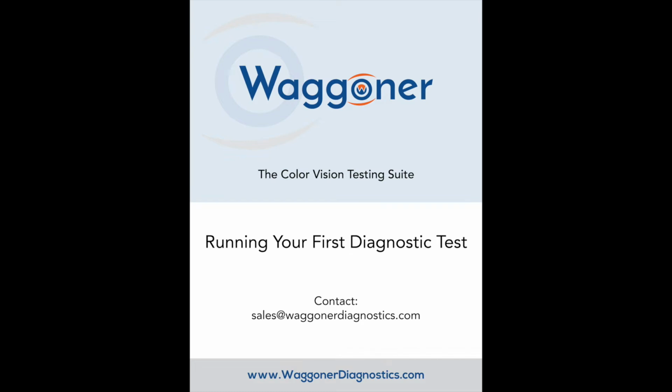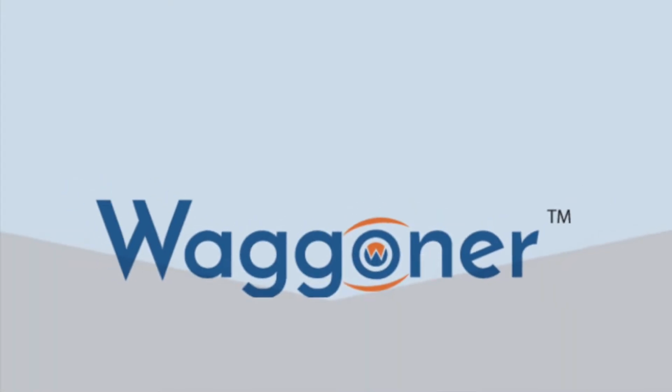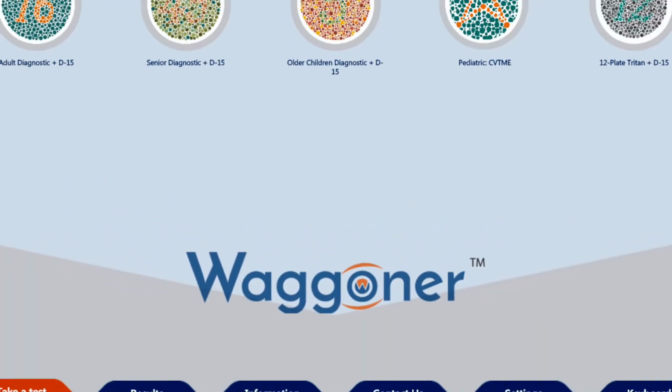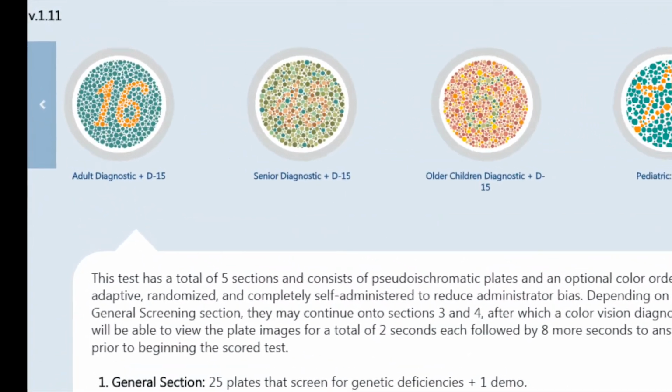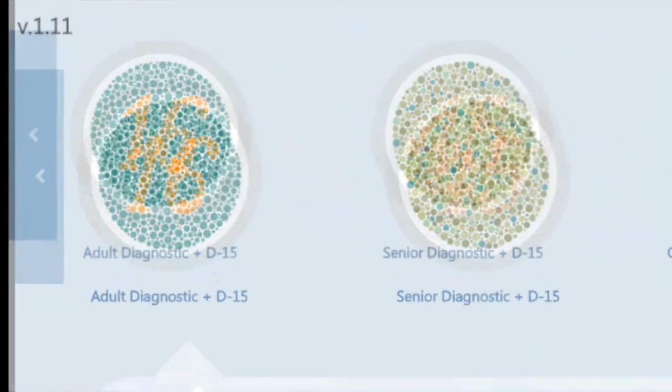Welcome to running your first diagnostic color vision test with the Waggoner Computerized Color Vision Test by Waggoner Diagnostics. For today's demonstration, we are going to be taking the Adult Diagnostic. The Adult Diagnostic test consists of 5 sections.